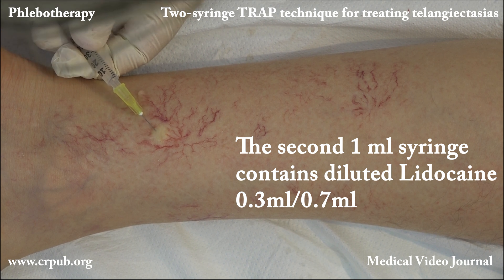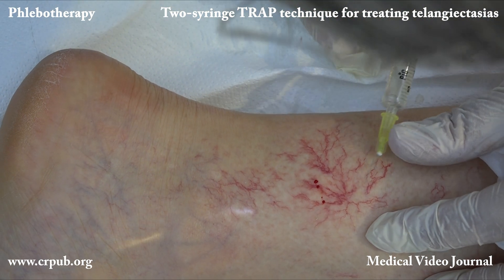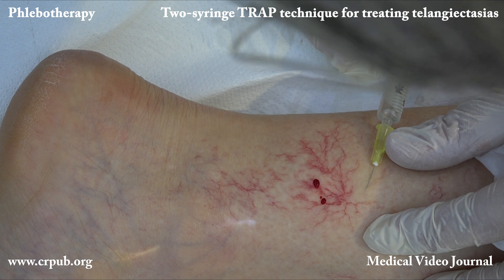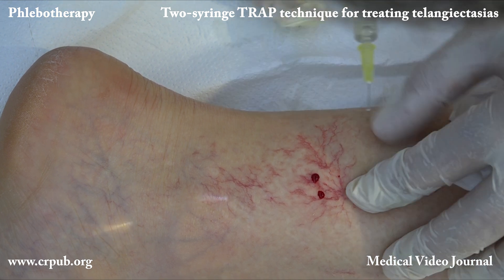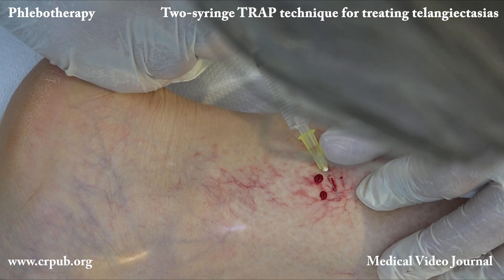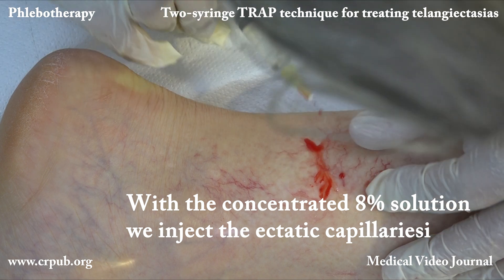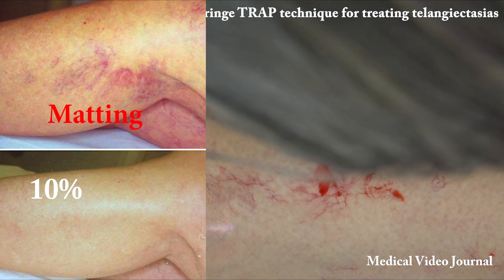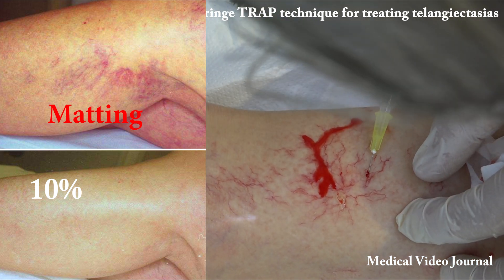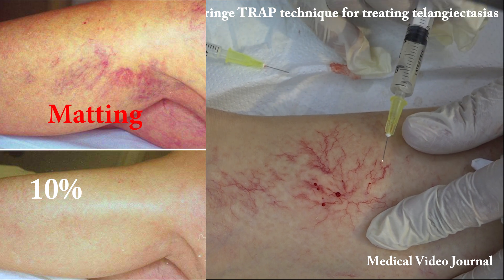The two-syringe technique uses one 2.5 milliliter syringe and one 1 milliliter syringe. Into the 2.5 milliliter syringe, we aspirate the 6% solution of sodium salicylate in a buffered hydroglycerin vehicle. Alternatively, we can aspirate 1.5 milliliters of 6% solution and 1.5 milliliters of 10% solution, combining these two concentrations to create an 8% solution. The 10% solution can be used to treat matting and high-pressure capillaries. We always add half a milliliter of 2% lidocaine to the vials containing the 6% and 10% solutions.